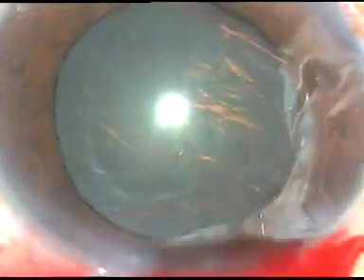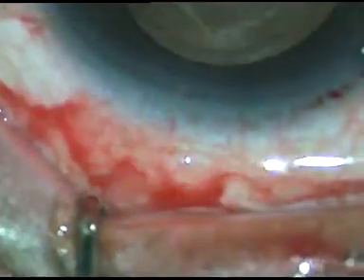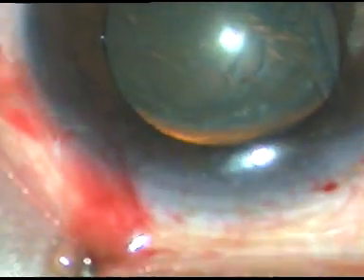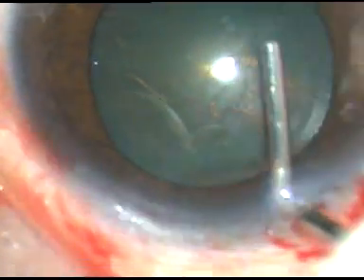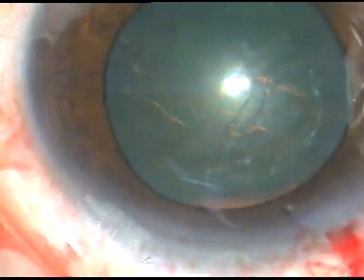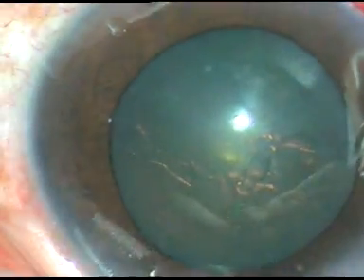Hydrodissection is to be done. BSS — that is balanced salt solution — is passed underneath the anterior capsular rim using a 27-gauge cannula. Some viscoelastic substance is expressed out. Hydrodissection is done. The fluid wave goes from one side to the other side, and the nucleus is depressed.